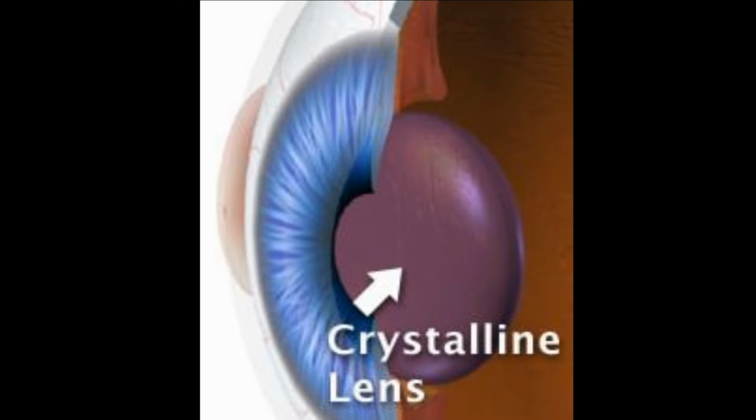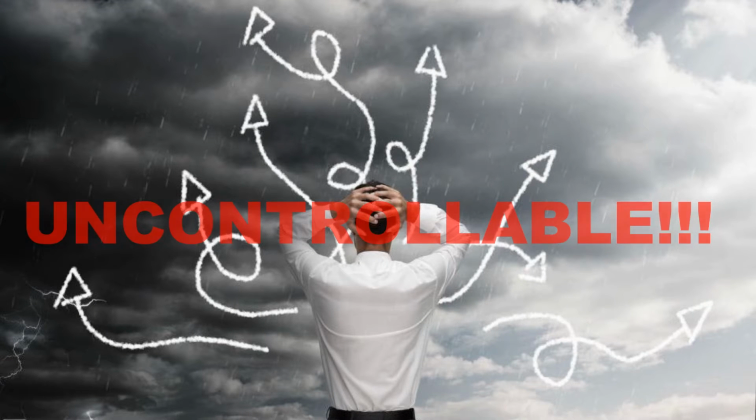The importance of fogging the eyes is to control the accommodation of the eye so that the crystalline lens does not change its shape to become less or more convex, as accommodation is an uncontrollable variable. When the eye accommodates, it may result in an inaccurate prescription. Controlling the accommodation moves the focal point to the front of the retina.